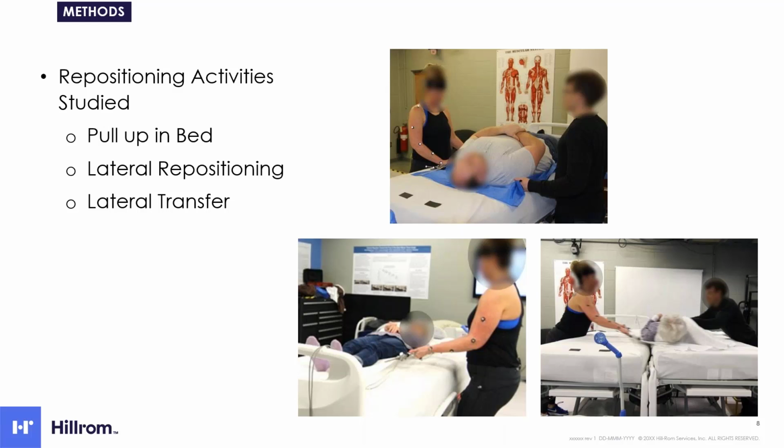So the pull-up in bed is also known as patient boosting. It is performed to move the patient up in the bed because patients slide down toward the foot of the bed. And pull-up in bed usually is performed by 2 persons, 2 caregivers. So we have a researcher on the other side of the patient helping pull the patient up.